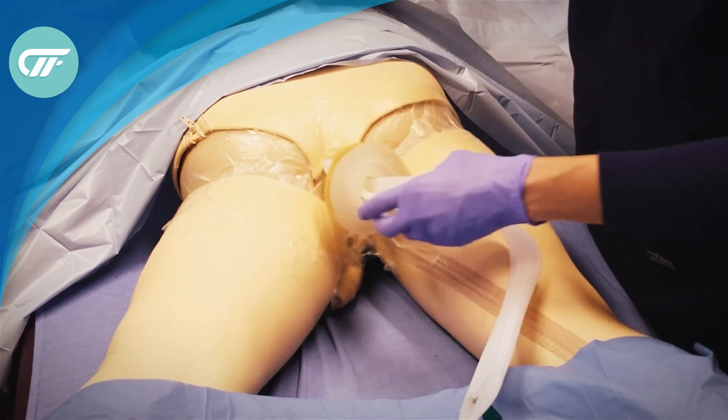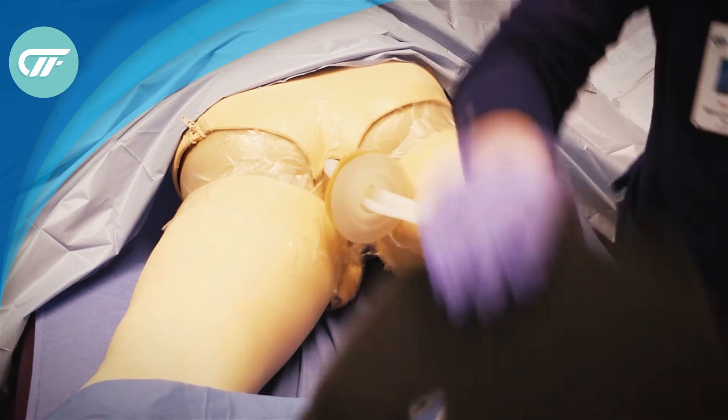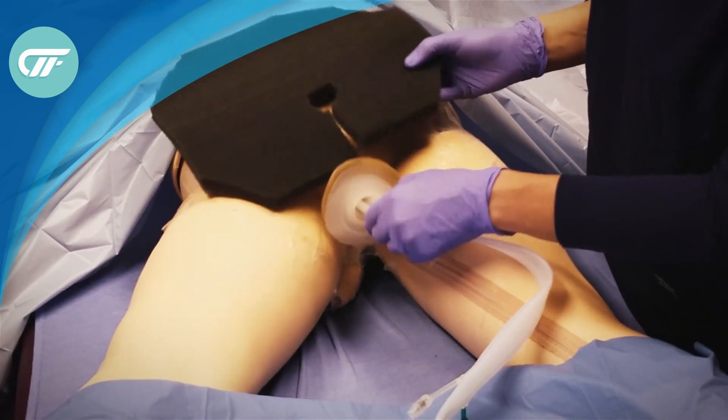Next you cut the foam dressing so that it fits around the fistula funnel.